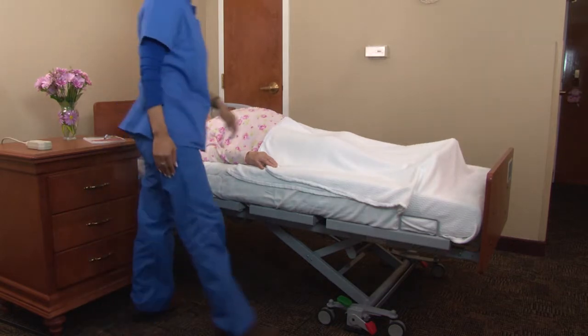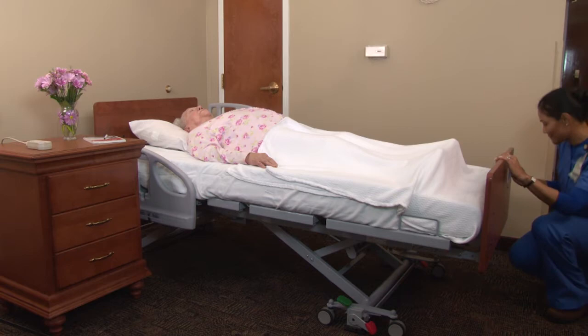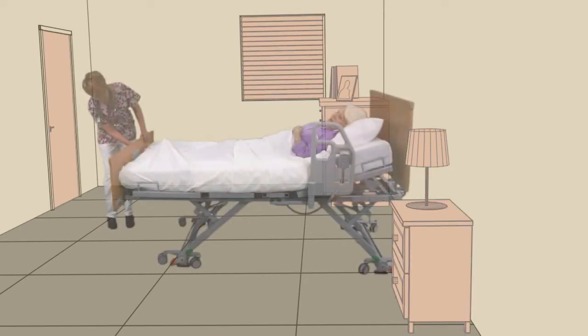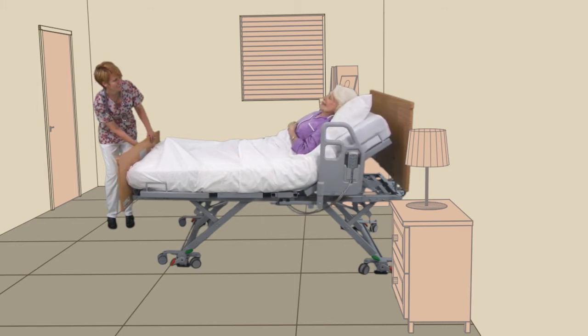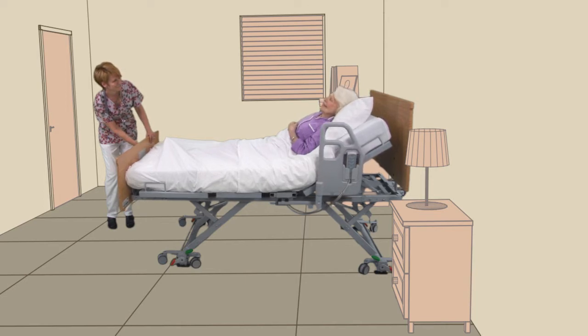However, most nurses do not think of the standard hospital bed as an intervention for prevention and treatment of certain conditions and complications, other than integrated therapeutic beds like low air loss or LAL beds, etc. MDs now order or have standard orders to raise the head of bed 30 to 45 degrees to prevent ventilator-associated pneumonia, or VAP, and 30 degrees for patients with feeding tubes.